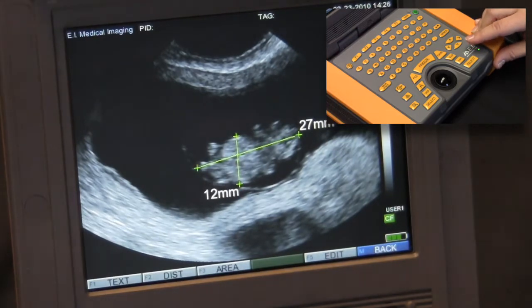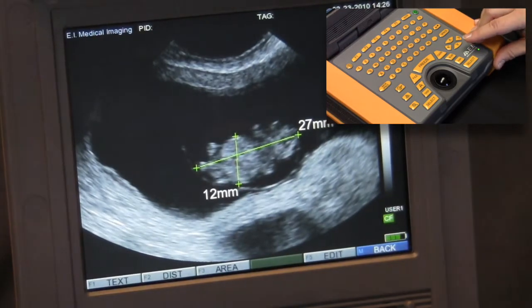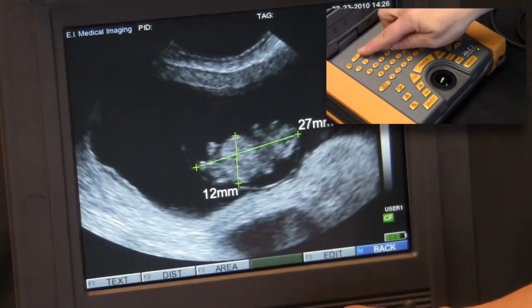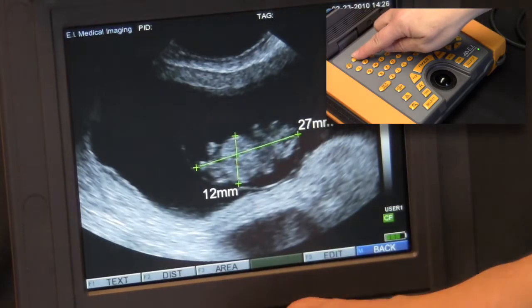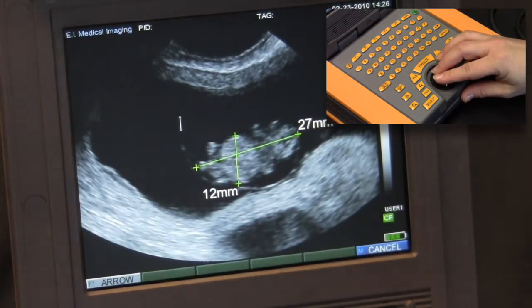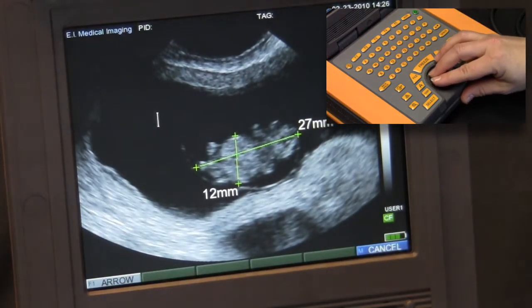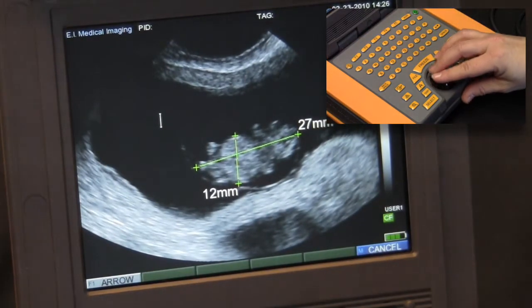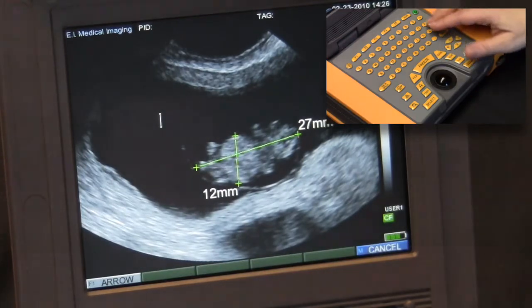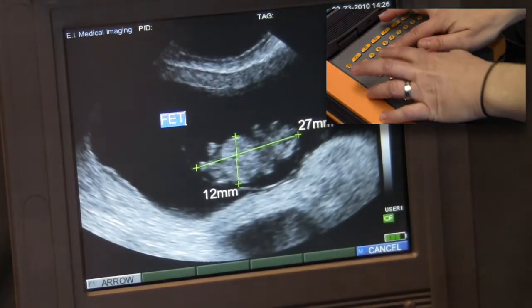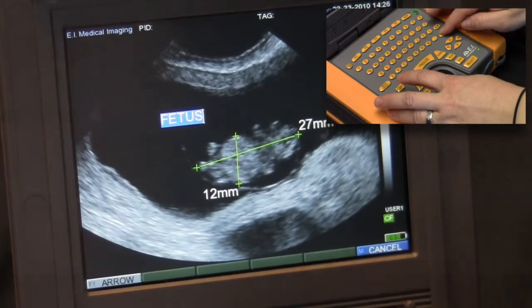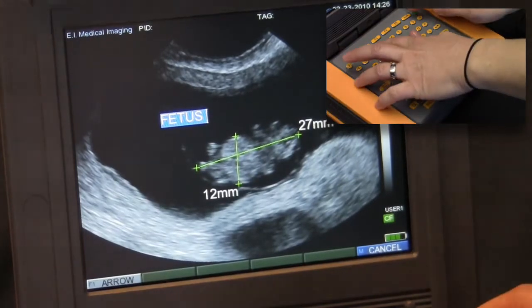Text can be added to the screen by selecting F1. Move the resulting cursor to where you'd like to make the annotation. Type your chosen tag and press the select key to commit the text.